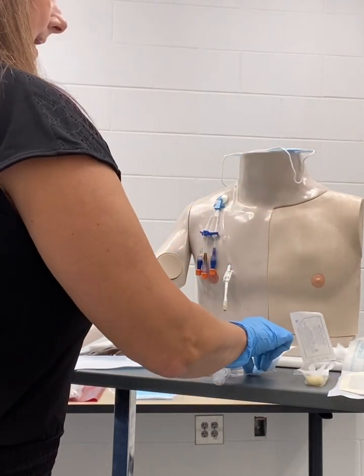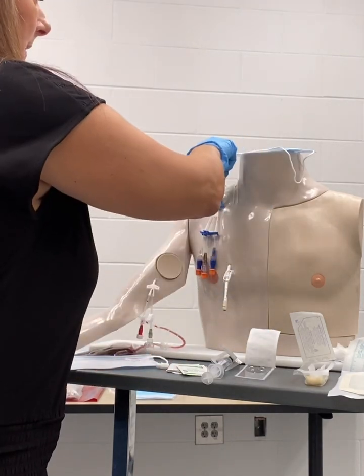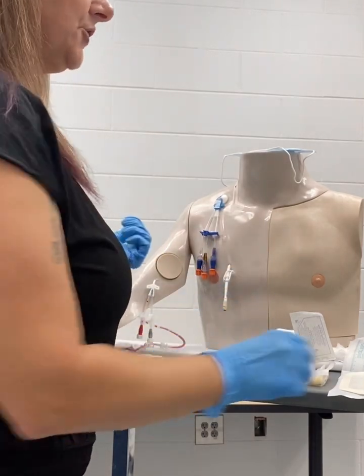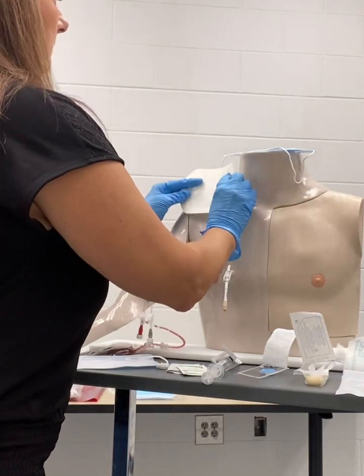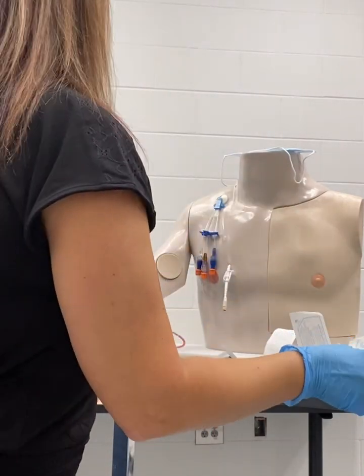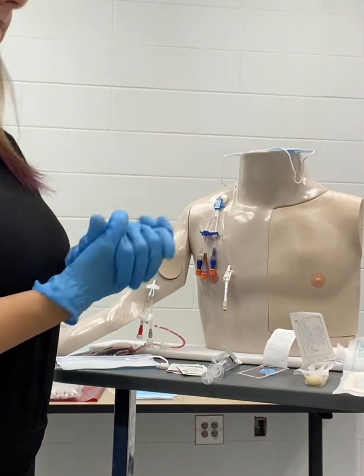As it's drying, once it's dry, I'm going to apply my new bio patch with my sterile hand. After applying my bio patch, I will apply a new tegaderm. I will date, time, and initial, and now I'm ready to change the caps on my lumens.